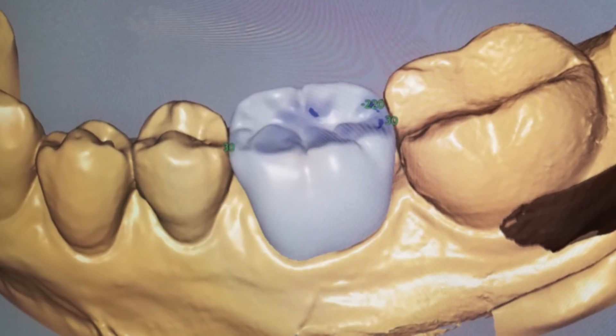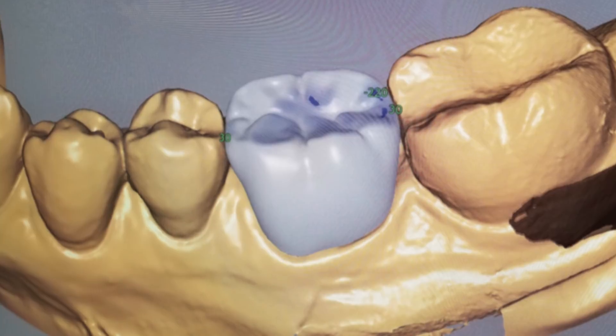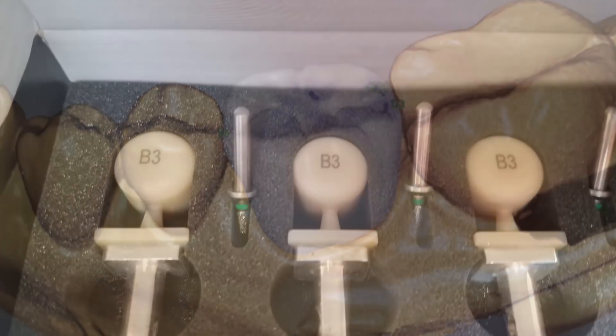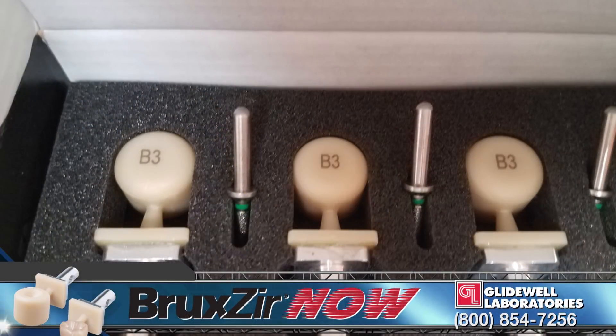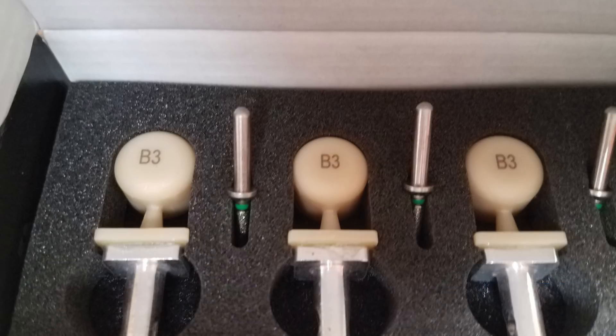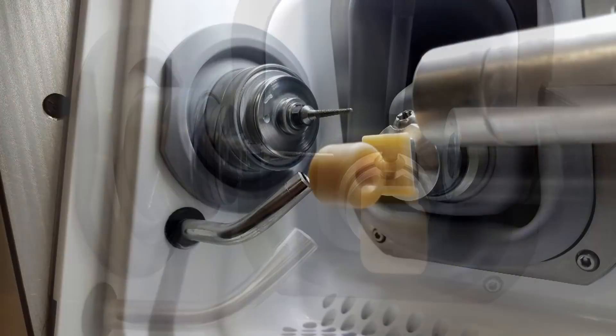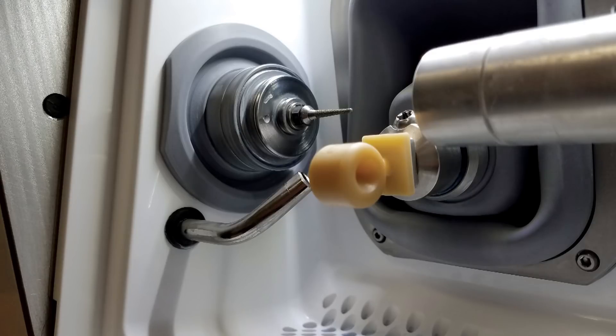Then the digital design file was sent to the Fast Mill for crown fabrication with the simple push of a button. The Bruxer Now zirconia milling blocks are pre-shaped in cylindrical form to minimize fabrication time. The blocks are also fully sintered, which eliminates the step of using an oven before delivering the dental restoration. A torque wrench was used to secure the Bruxer Now block to the Fast Mill for fabrication of the crown.